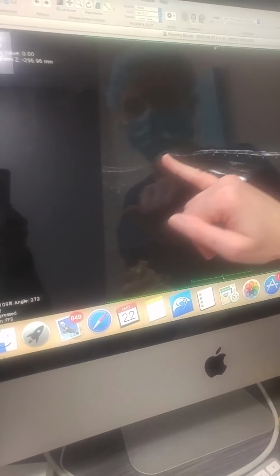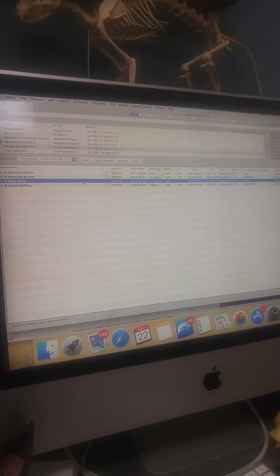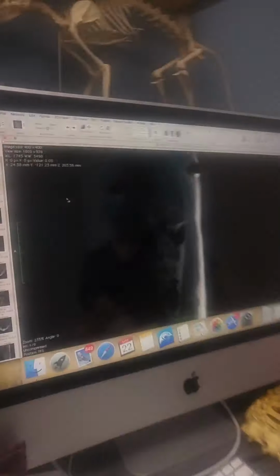You see that probably, right? Okay, it's supposed to still be straight. Yeah, and if you don't mind, I'll just show you a more normal spine, if you don't mind, two seconds. You'll have to forget the names. Don't worry, we're both in healthcare.